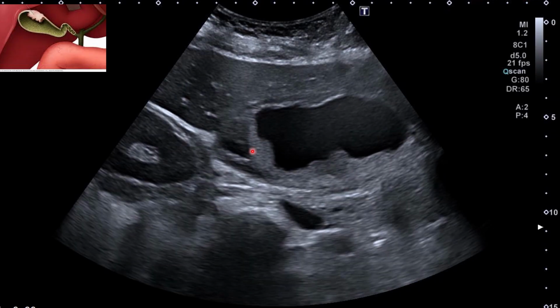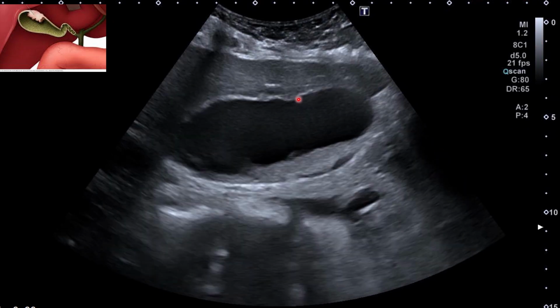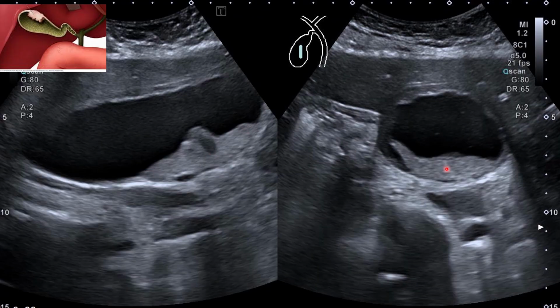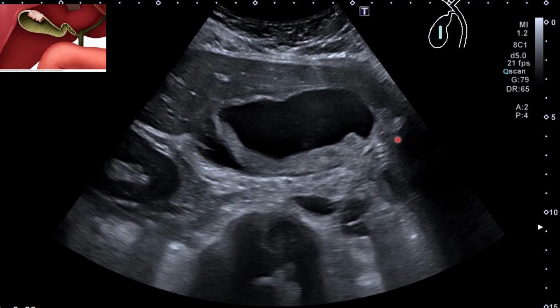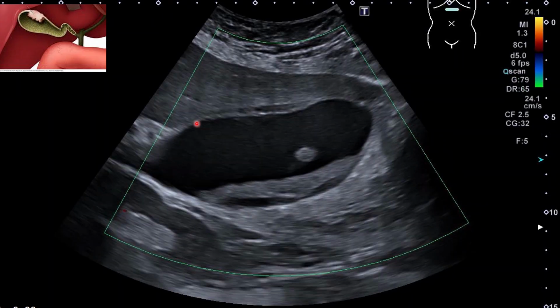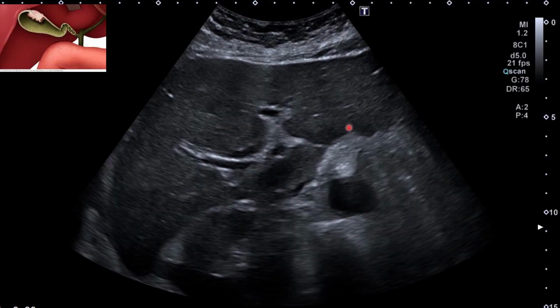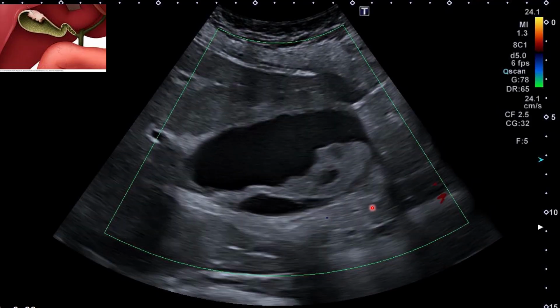So this is a very, very difficult diagnosis to make, because there can be two things which can be involved in this case. See the mass there. If you look at this side, it looks more detached like that. So this is one of the most complicated diagnoses to make, because there are two differentials which can be confusing.